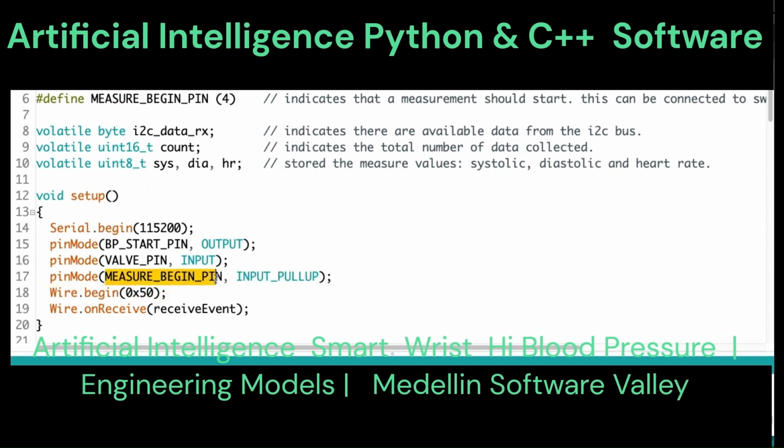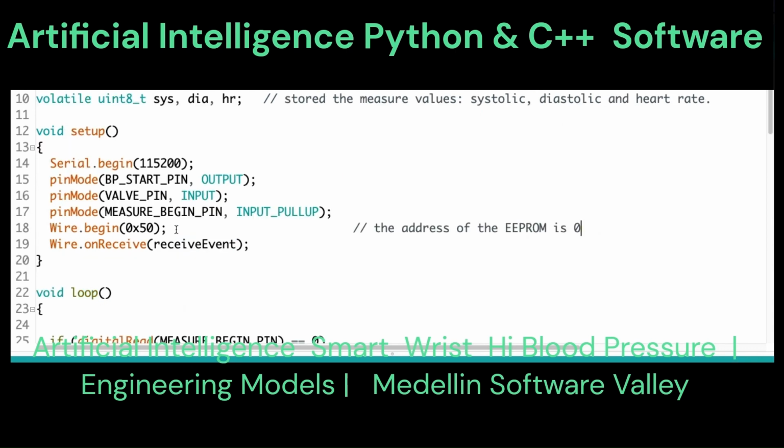As the air pressure drops on the cuff, the pulse detected by the sensor will gradually disappear, and that is when the diastolic pressure values are obtained.